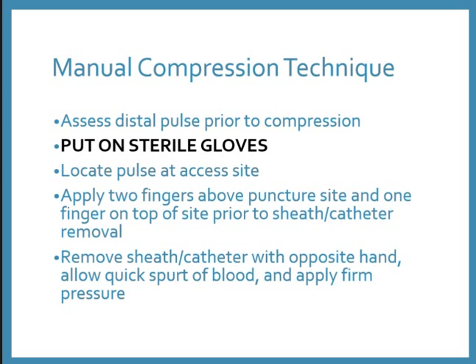So before you do any of this, you should locate the pulse and tape a flathead Doppler on top of the foot, so you know exactly by listening if you've occluded the pulse, and you can time it more accurately. The other thing you can do, if you cannot find the flathead Doppler, would be to put a pulse ox on the toe, and when you occlude the pulse, you will see a flat line.